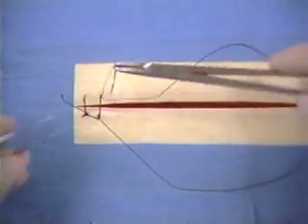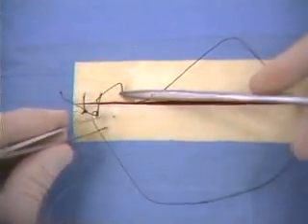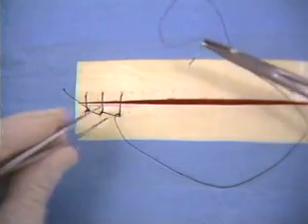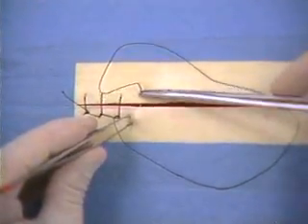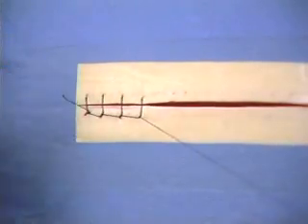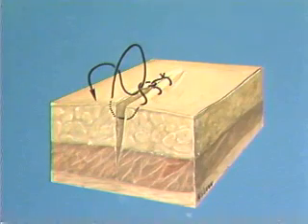The needle is advanced, a loop is formed, and the needle is passed perpendicularly through the tissues in the same direction. After the needle is passed from the tissues, it is drawn through the pre-formed loop and tightened. The pattern is repeated for the length of the incision. This illustration shows a completed Ford interlocking suture.